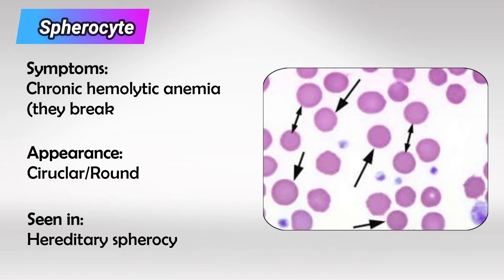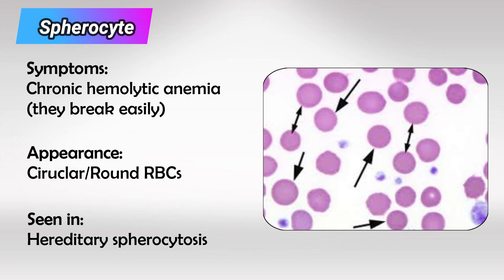Next we have spherocytes, and these are commonly seen in hereditary spherocytosis. They cause chronic hemolytic anemia. These can also be normal findings in blood samples that are left in the air for long periods of time.